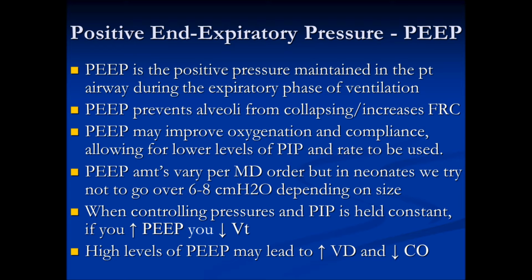And also, you don't have to have very high rates as well. So with PEEP, because I mentioned earlier the difference between your PIP and your PEEP is what you're really ventilating with. If you have a baby who has compliance problems, because you can incorporate higher levels of PEEP, you then don't have to use the same PIP level that you were using previously before you went up.